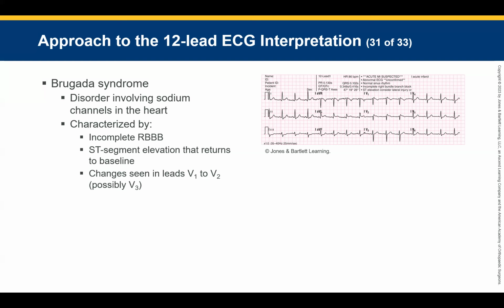Are you two okay? You look like you're struggling. I just, well, I understand why, but I'm confused about where we start. I get we start with V1, but then after that, I'm kind of lost in the order. So we always go in order, but by order of location.